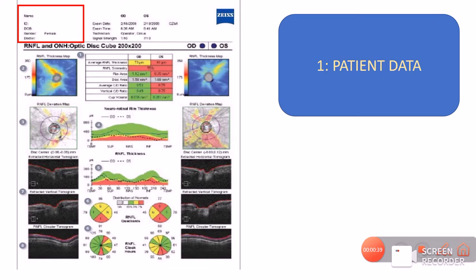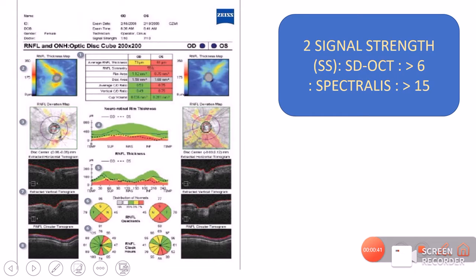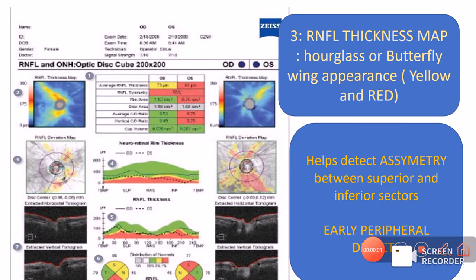The next parameter to consider is the signal strength, given by the manufacturer and important for assessing image quality. We only proceed with reading the OCT printout if the image quality is good. The signal strength for Cirrus SD-OCT should be more than 6, for Spectralis more than 15, and for Avanti more than 30. Signal strength should always be assessed before reading the printout.